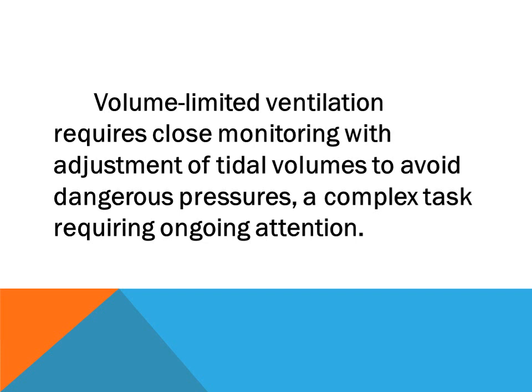Volume limited ventilation requires close monitoring with adjustment of tidal volume. We have to monitor the tidal volume and titrate or increase it depending on the patient's pressure, because sometimes it causes a dangerous rise in pressure that goes beyond the safe level and causes complications for the patient. So in such patients, ongoing observation should be done.